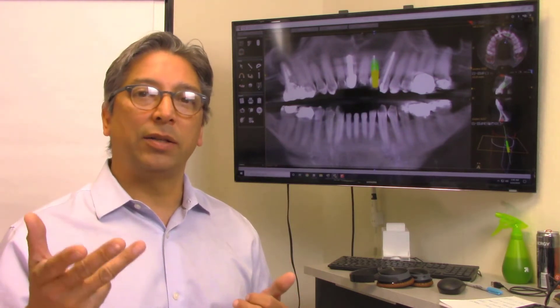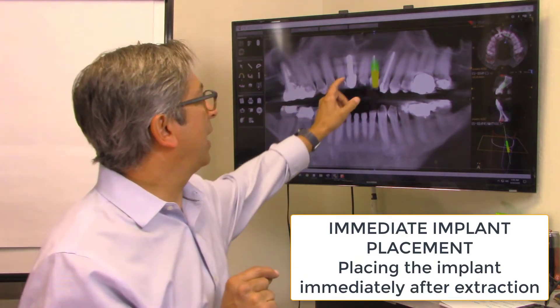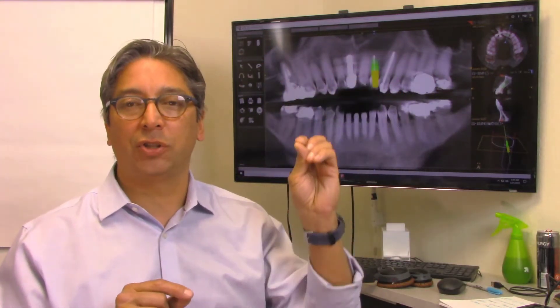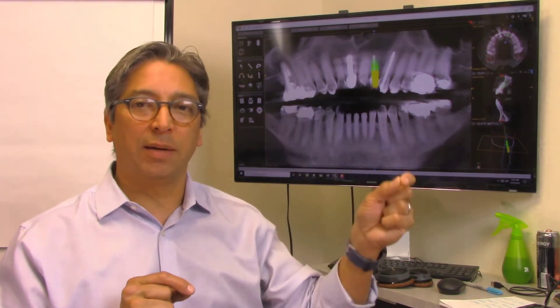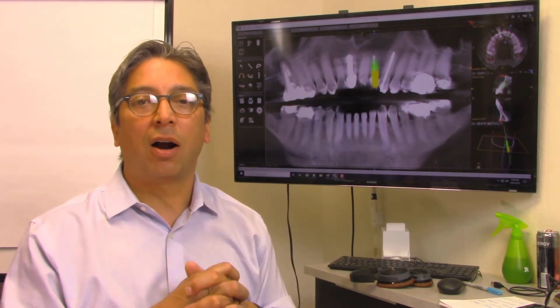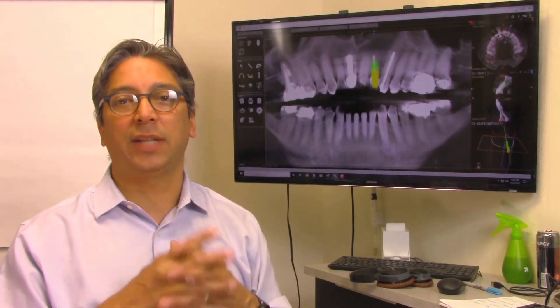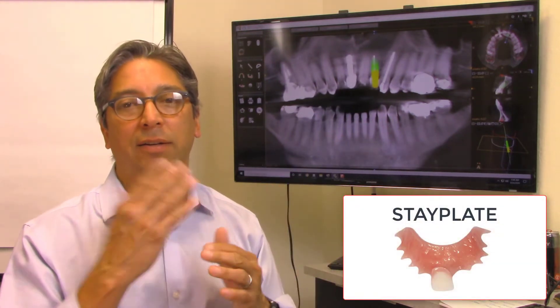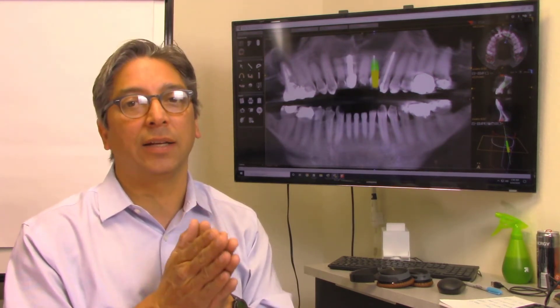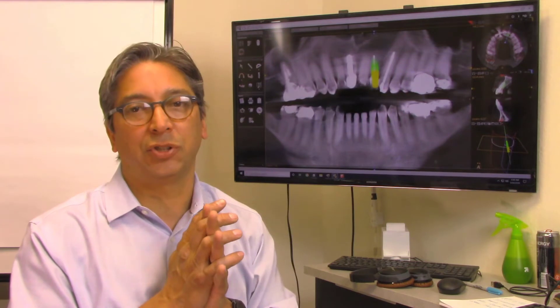What I want to discuss is the immediate placement element using a CT, looking at the length, and how to make a decision whether or not you should graft the case when you put the implant in, whether or not you should put a healing collar, and what the benefits of all these things are before we collapse the gum line. This person is going to get a stay plate for this one tooth, out of the bite and not pinching on the wound site. In this case I put in a healing collar to help keep the contour of the tissue there in place.